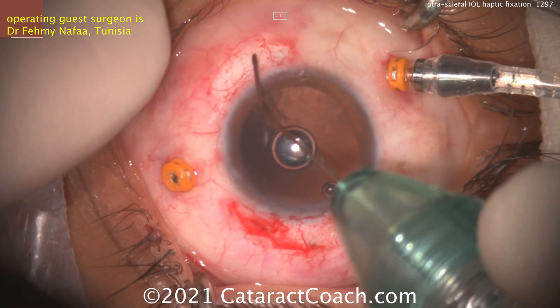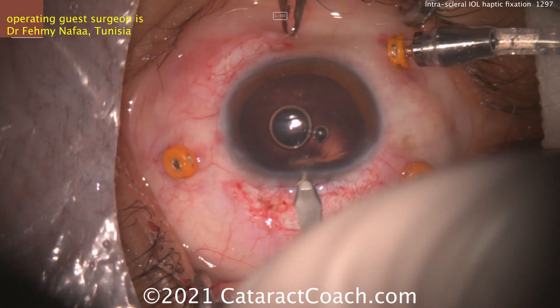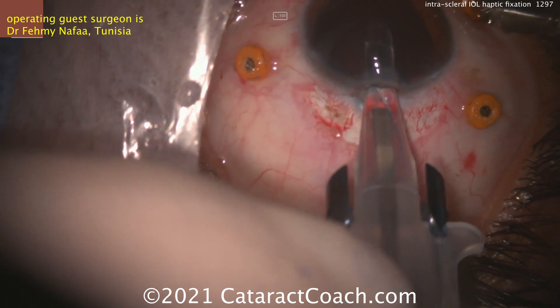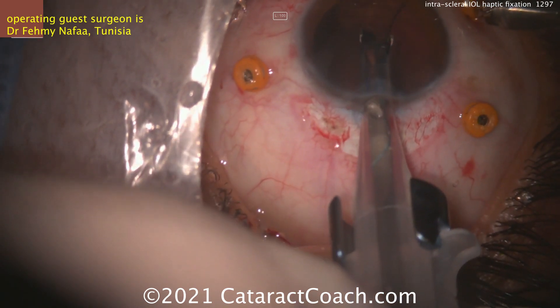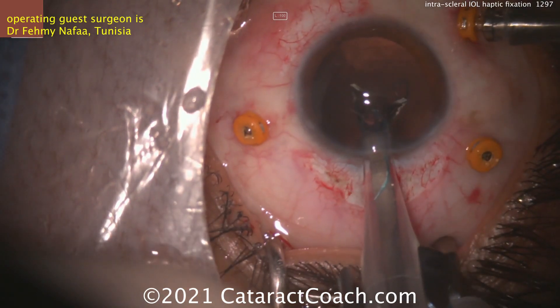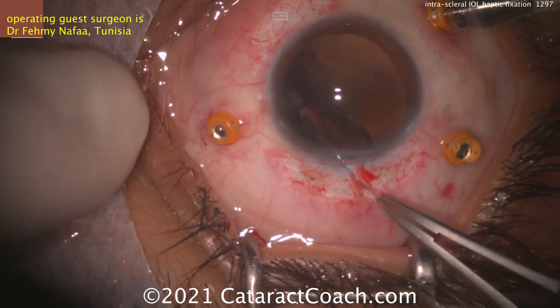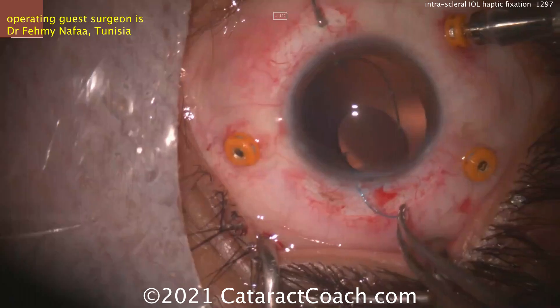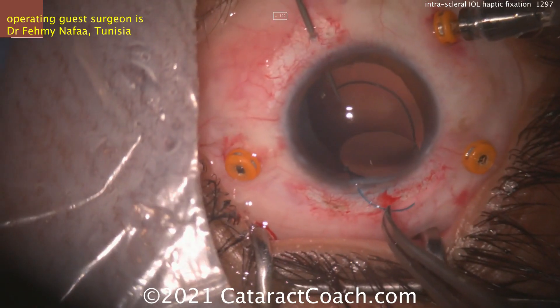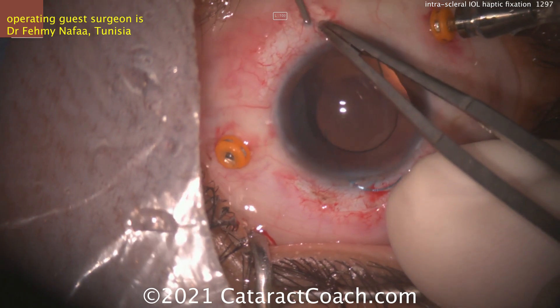Putting in some viscoelastic — try to have this mostly in the anterior chamber; you don't want it going down into the vitreous cavity too much. Planning out where these pockets are going to be made. Here comes the IOL to be injected inside — the first haptic goes in. Don't fully inject the lens yet. He rotates the lens to bring the one haptic towards that area, and the micro forceps are placed inside the eye, leaving the other haptic outside so the IOL will not fall back. Grabbing that haptic with 25-gauge forceps and pulling it through the sclerotomy.